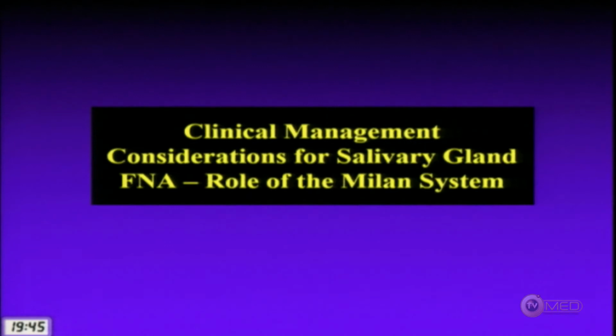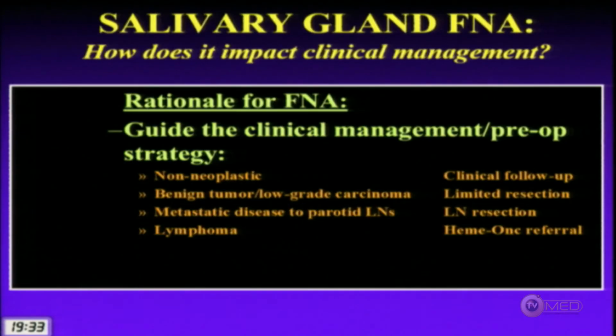Before I go through each of the diagnostic categories and tell you a little bit of detail about them, I just want to say a few more words about the clinical management considerations for salivary gland cytology and the role of the Milan system. So in terms of salivary gland FNA, how does it impact clinical management? This is how it really happens. If we can call a salivary gland FNA non-neoplastic, some kind of inflammatory condition, then that patient is probably going to just get good radiologic imaging and clinical follow-up. They can possibly avoid surgery.